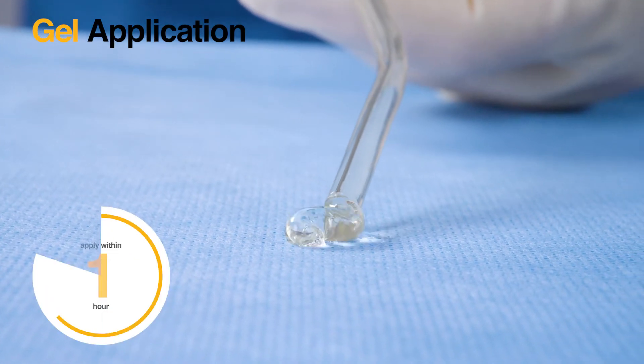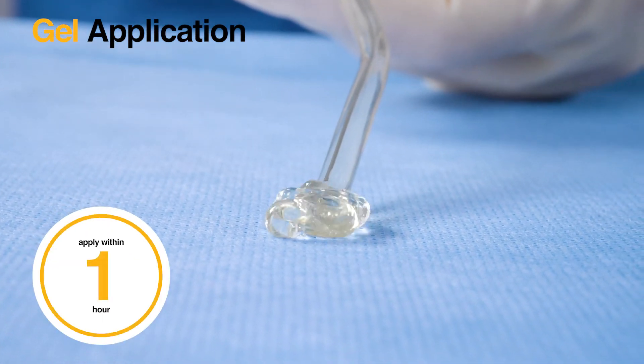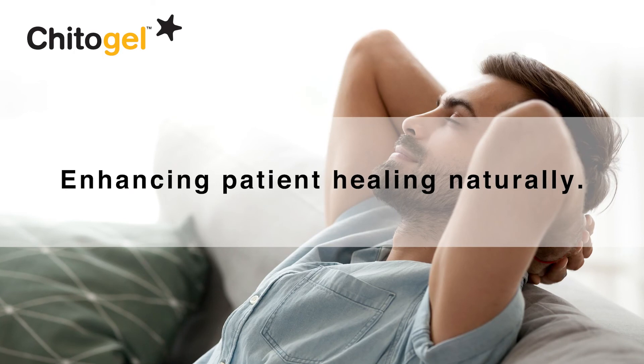The gel should be used within 1 hour. Enhancing patient healing naturally.